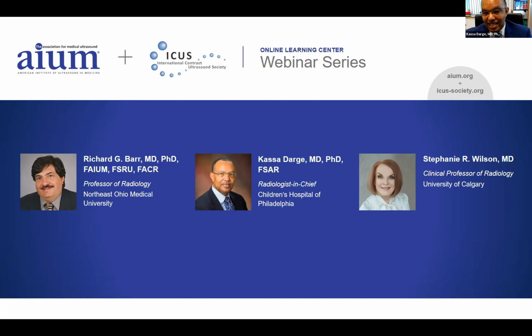If there's excessive motion, one thing that might be a disadvantage is if you're doing a dynamic scan and creating a time intensity curve. Sometimes you have issues if there is so much motion that it's out of the plane. But otherwise, for diagnostic purposes, that is not a major consideration. And that's actually one of the major advantages, being able to do contrast ultrasound in the setting of motion. Great, that's great. Thanks, Kassa.